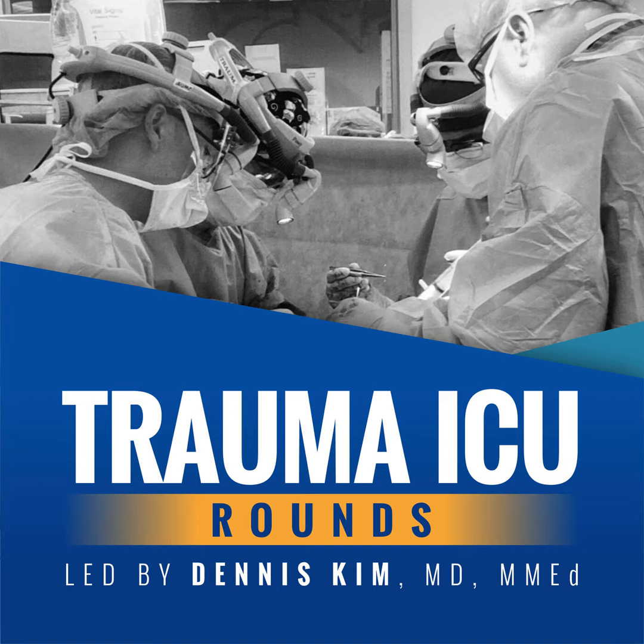We've already touched a little bit upon the cardiovascular status, but other criteria that you may see look at things like heart rate or the absence of significant tachycardia. And then from a pulmonary system, and this is probably one of the most important, ensuring that they have adequate oxygenation indices. So whether you want to go with O2 sats, the PF ratio probably isn't that helpful, but here's where you're really looking at a constellation of symptoms and signs.